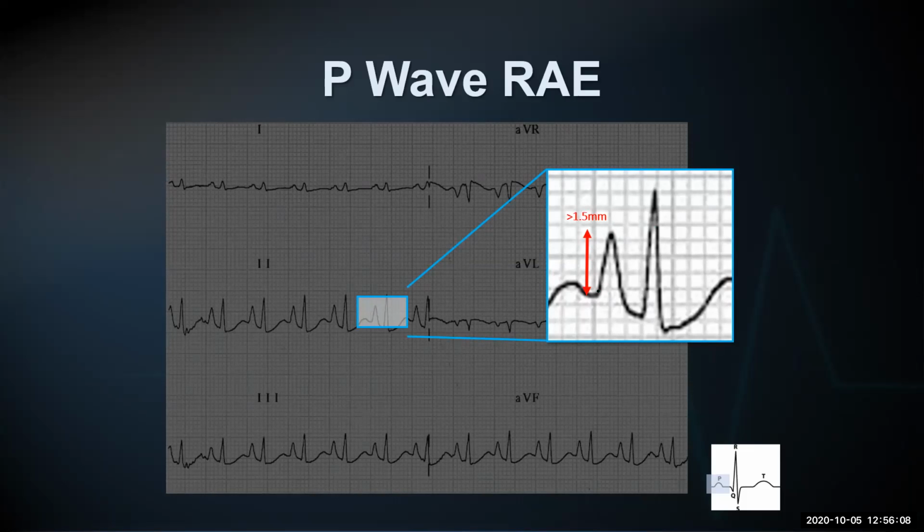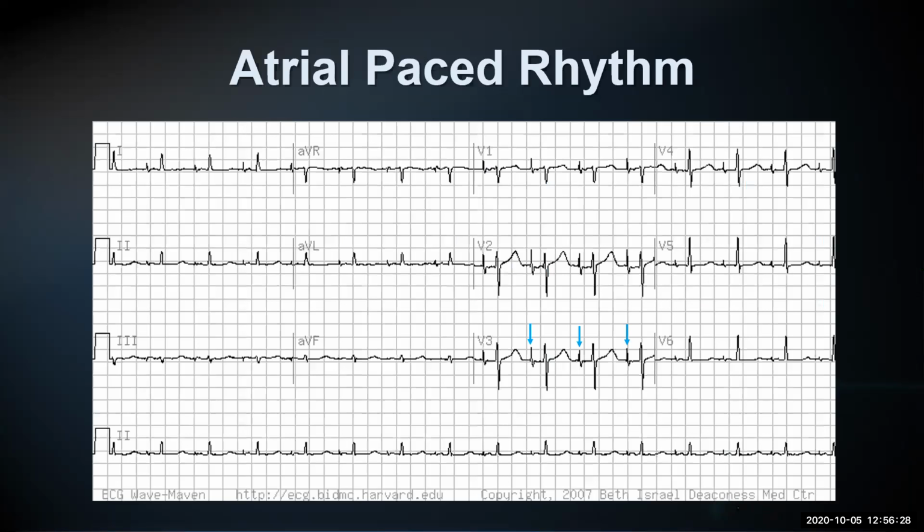But in this one, you can see that it's hard to tell if this P wave encompassed part of the previous T wave as well. But if it did, you can see that the second portion of the P wave, or even the enlargement itself, is very enlarged in comparison to the QRS complex. I don't have the calibration box, but we would assume that the calibration box is 2 large boxes.